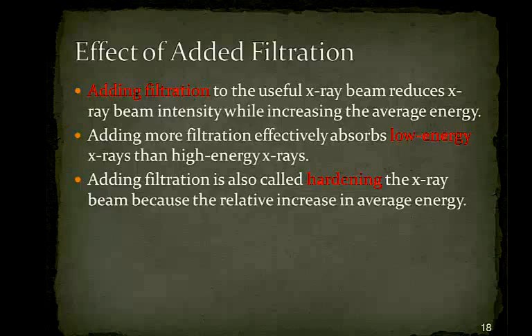By getting rid of the low energy X-rays, you increase the average energy. So just to give you some numbers, if I say 100, 90, 90, 90, 80, 70, 60, and the next three numbers after 60, let's say are 10, 5, and 7.